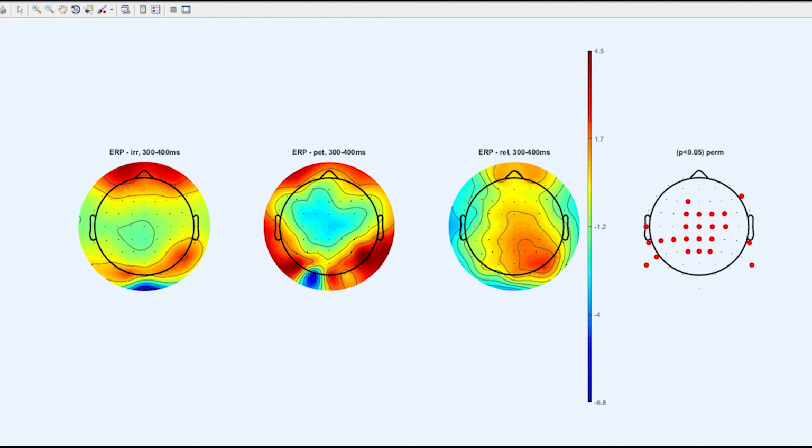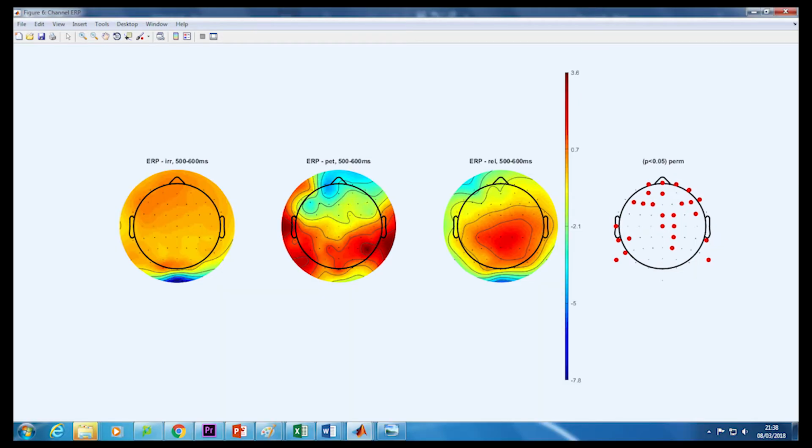Due to research suggestions that the P3 occurs when the brain pays attention to a certain stimulus, this could suggest that the oddball stimuli of the PET spikes a P3 component, as the participant is not expecting this image and therefore pays more attention to the image. The oddball stimulus continues to have a positive reading up until the end of the stimuli display, suggesting this has a longer lasting potential than the other types of stimuli.